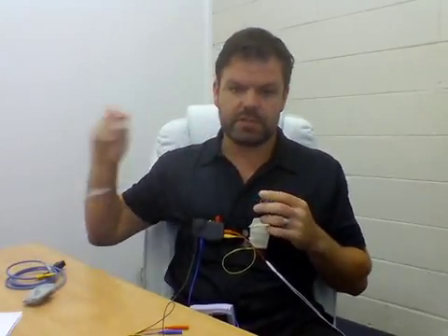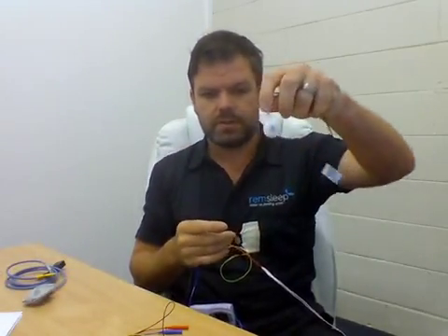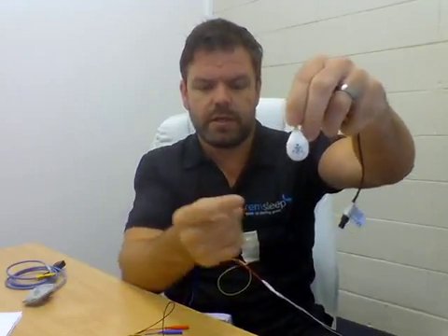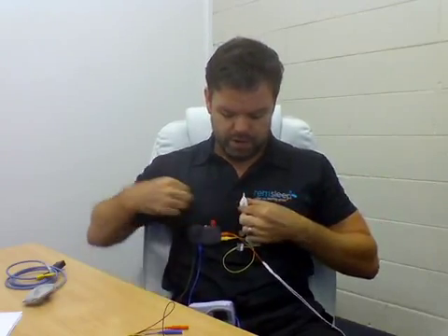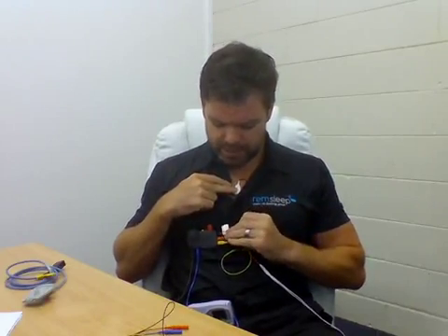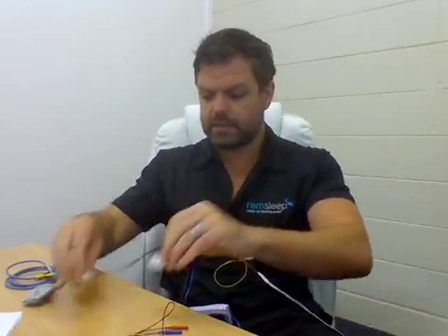Step 6 is the position sensor. This is what the position sensor looks like. It's got an L and an R, so obviously, left goes left, right goes right. And if you want, you just tape that down on your skin with the tape provided. Just tape it nice and centered there, and that plugs into the black one on the head box. Nice and easy.